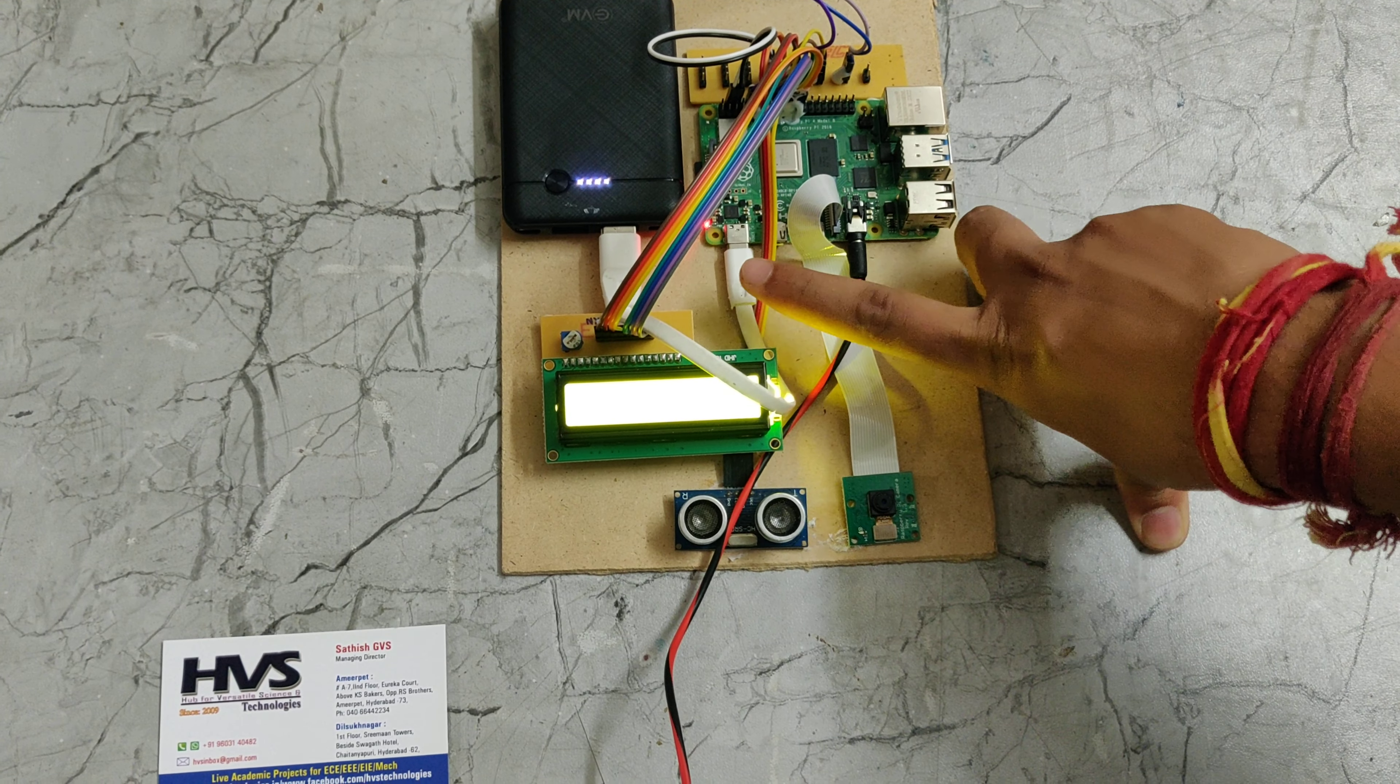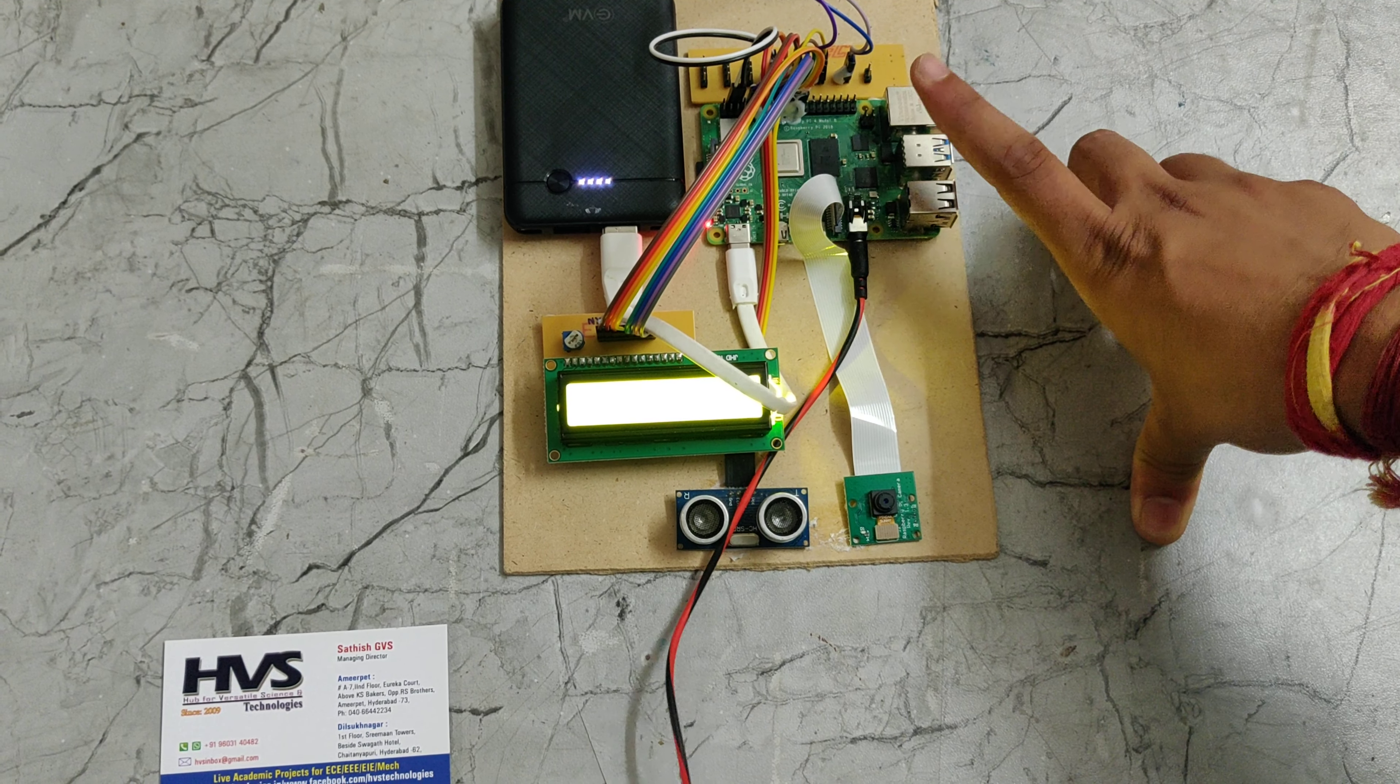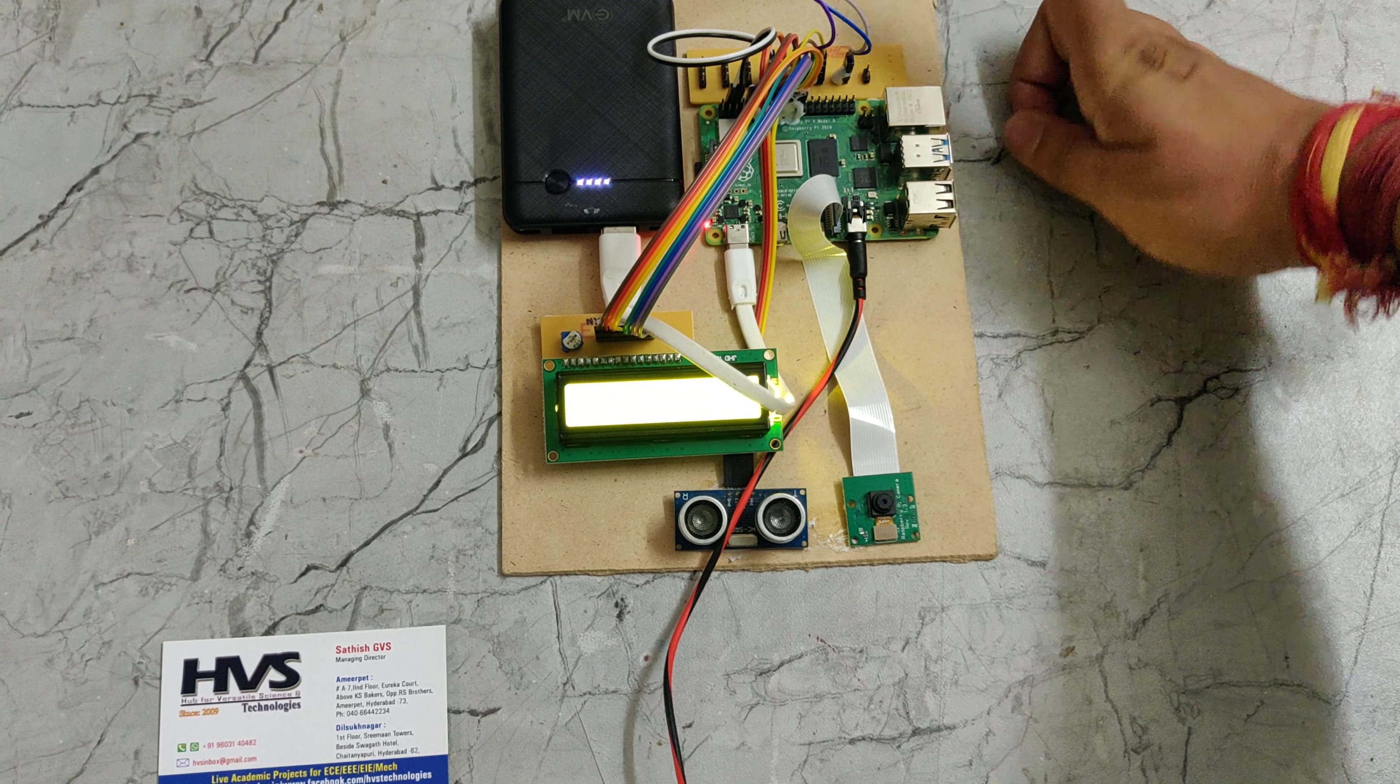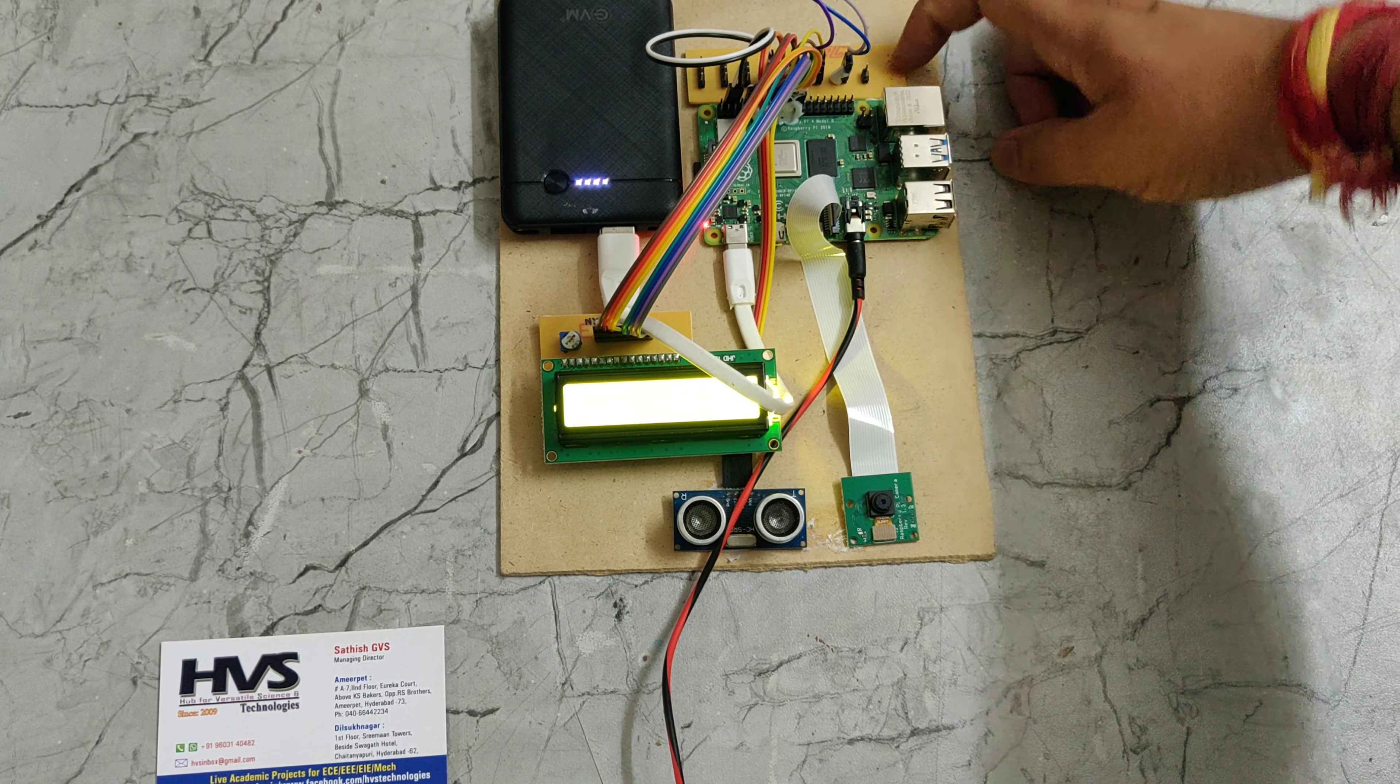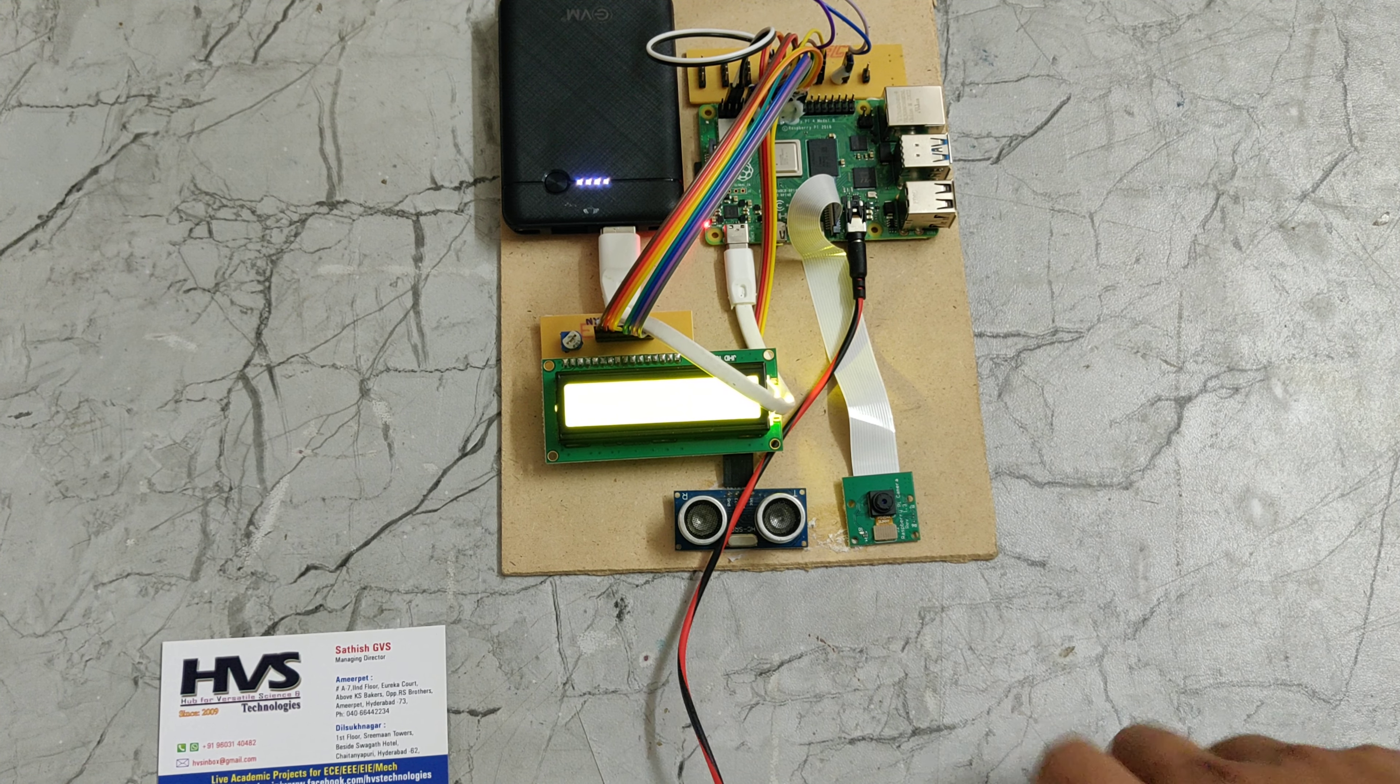We are providing the 5V power supply for this Raspberry Pi. Using this Raspberry Pi we are giving the power supply to this track PCB. The track PCB equally divides the 5V power supply to these components. These components work on the 5V power supply only.